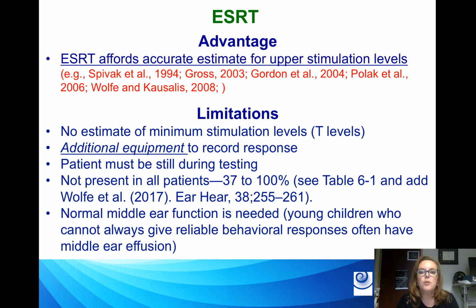And it's very possible that the reason they hadn't been measured in the past was simply due to the probe tone that was used. So we do need to look at that a little bit more carefully. And of course, with younger children, this is really difficult.